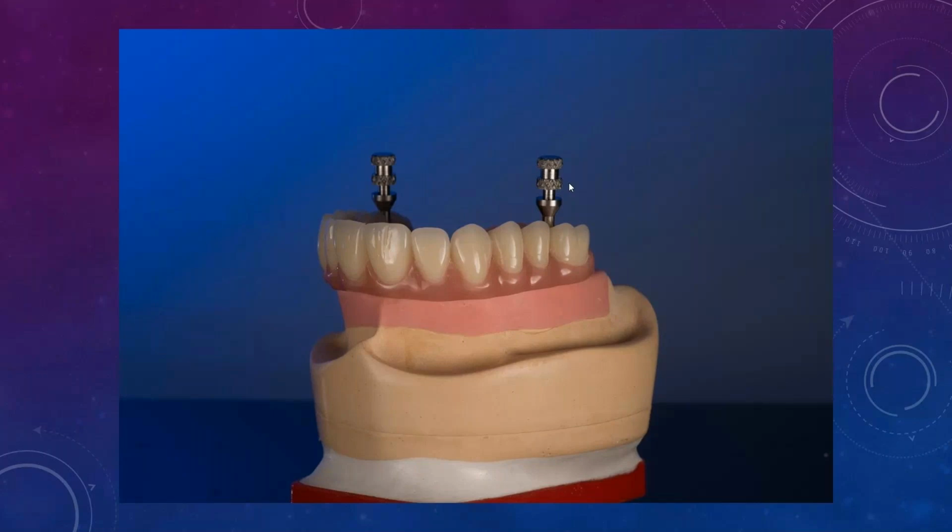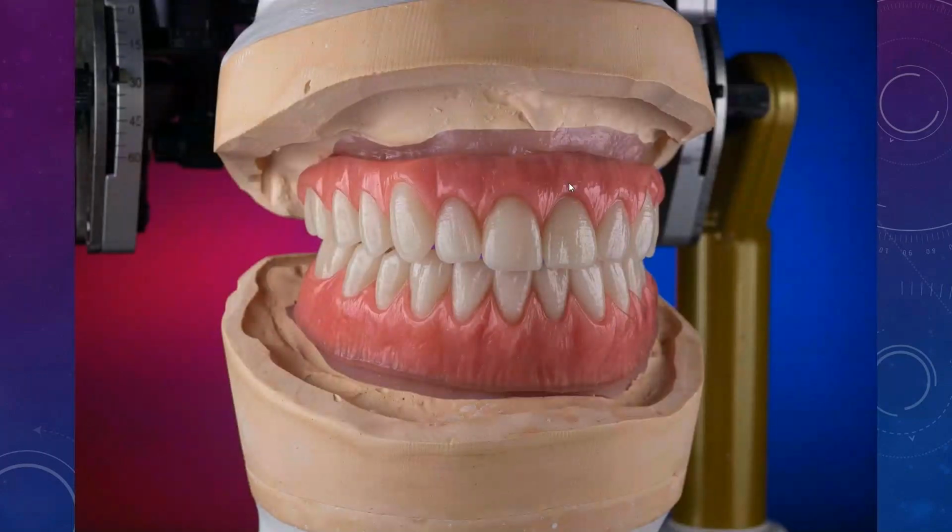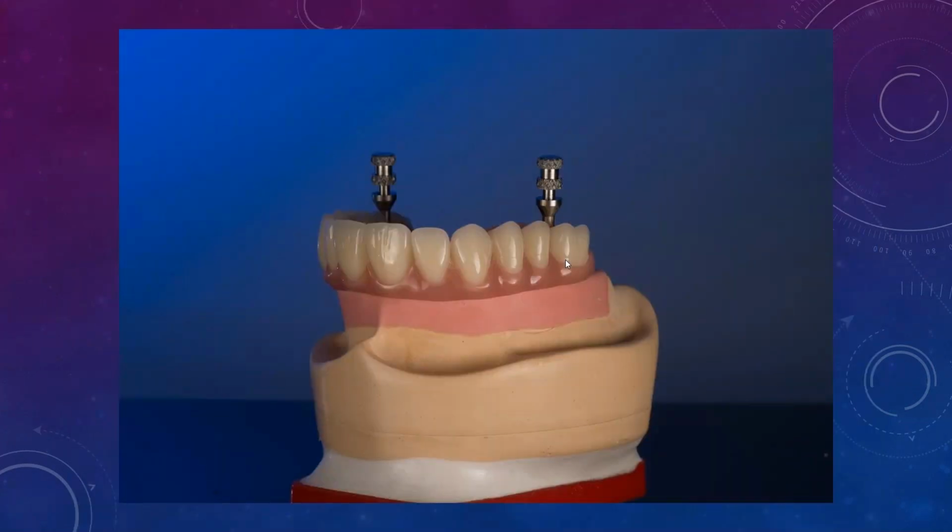Okay. Now, what I wanted to mention is that the try-ins, or the wax rims for that matter, are done on locators. I have it on a slide a little bit later. I use little conversion abutments, not adapters, from multi-unit to locator. I buy them from Blue Sky Bio. They cost about $25 each, not expensive. Great for stuff like this. I wouldn't use them for permanent restorations, but for try-ins, they work great. So if you end up making a whole new model because the setup is on locators, that little discrepancy wouldn't affect it, because it will still snap perfectly on those locators. Okay.